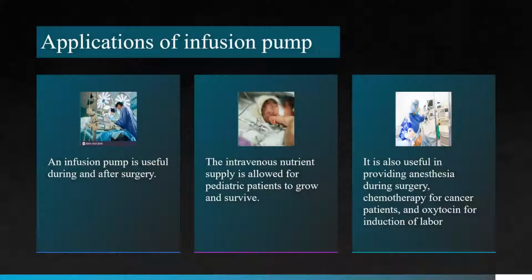Applications of infusion pump. An infusion pump is useful during and after surgery. The intravenous nutrient supply allows pediatric patients to grow and survive. It is also useful in providing anesthesia during surgery, chemotherapy for cancer patients, and oxytocin for induction of labor.